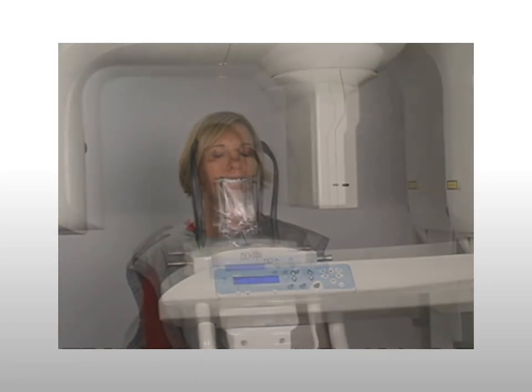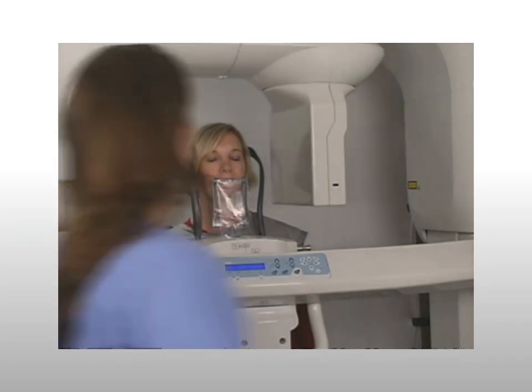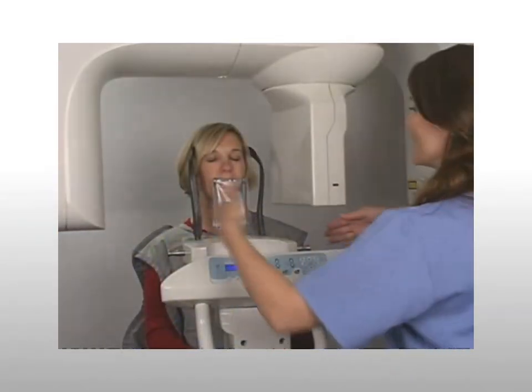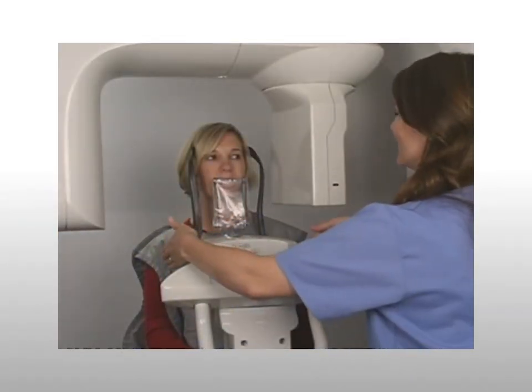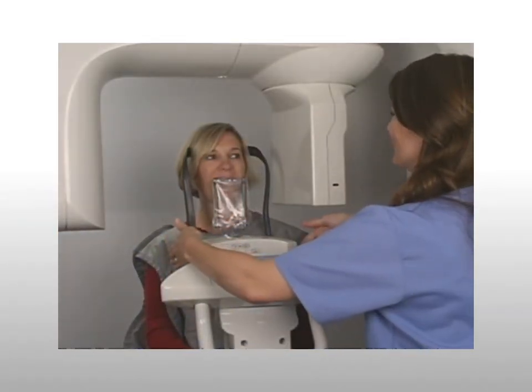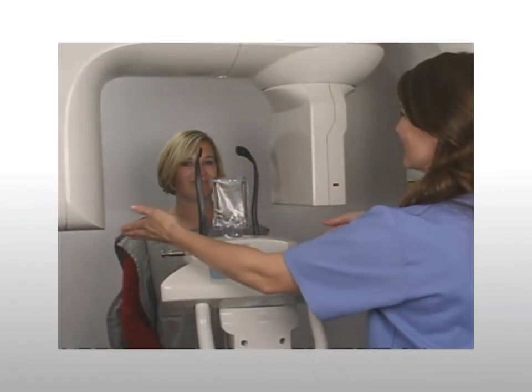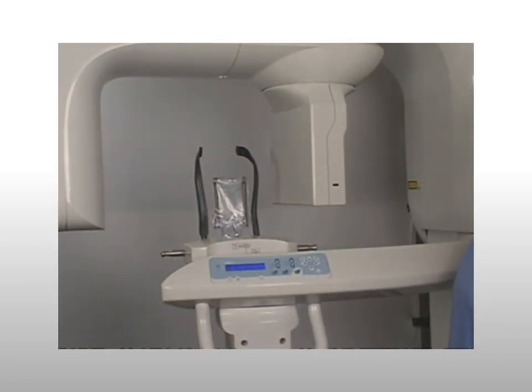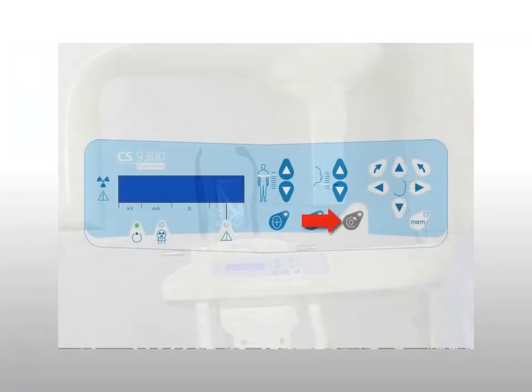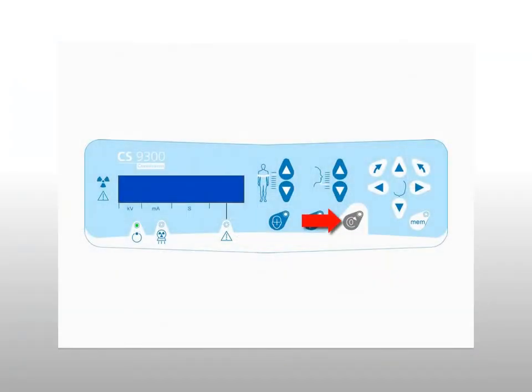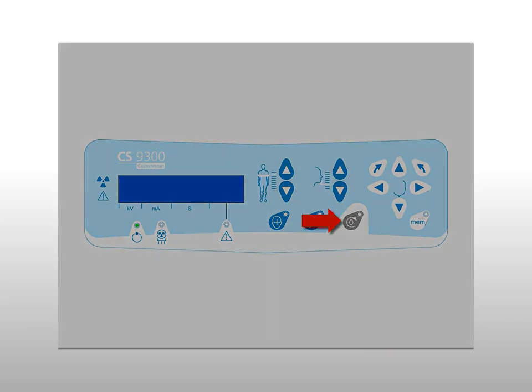After the acquisition is complete, return to the room, open the temple supports, and assist the patient in exiting the machine. To ensure the machine is ready for the next patient, press the reset button on the control panel — this returns the unit to the home position.